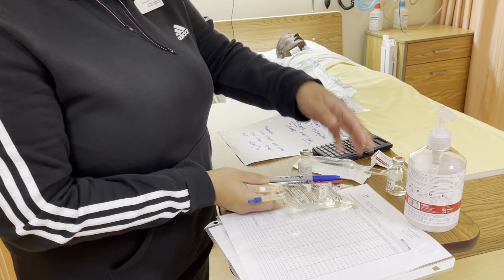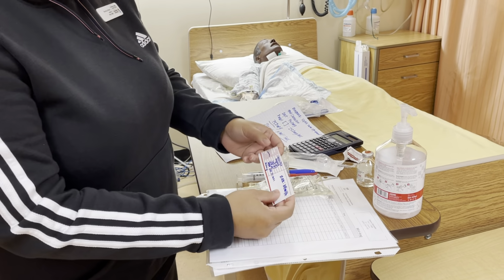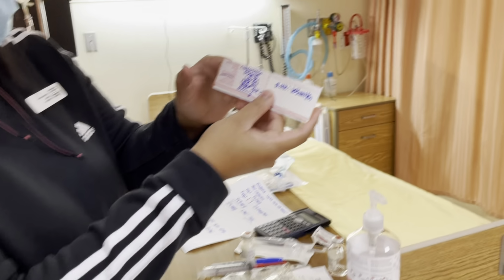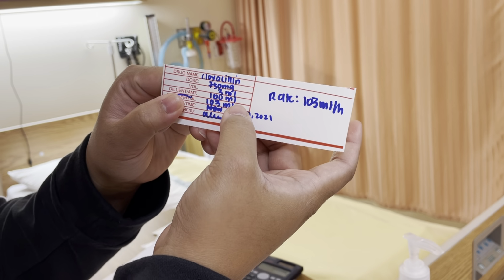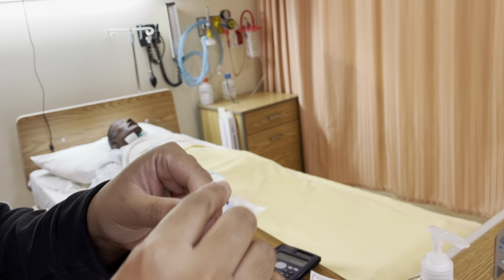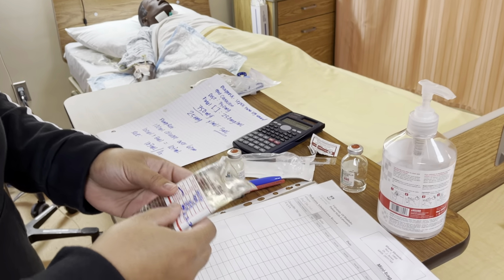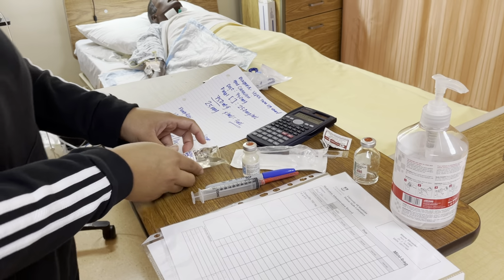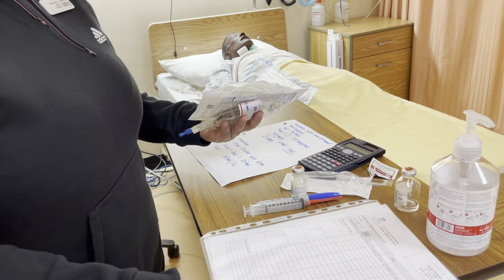And then I've already prepared my medication label. So for Cloxacillin, 750 milligram, I have 3 ml in 100 mils diluent, so 103 ml, and today's date and my signature. We're gonna attach this to the bag. And then we'll head into our patient's room with alcohol swabs or secondary tubing as well as my MAR.